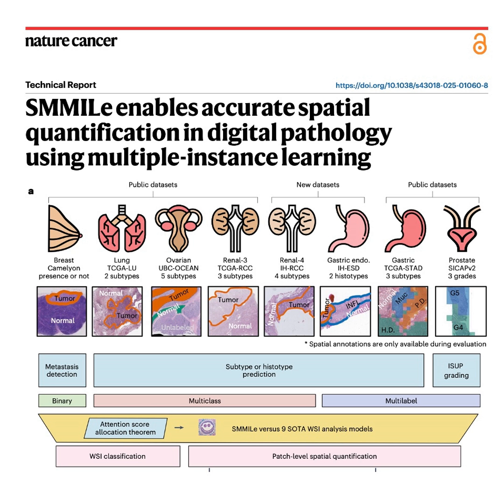But you don't just train an AI on cancer, you have to train it on healthy tissue too, which is where the consistency constraint comes in. Right. This is applied only to the negative bags, the slides with no tumor. Because if there's no cancer, the model shouldn't be fixating its attention anywhere. Exactly. The framework uses a mean-squared error loss function to force the model's attention to be completely uniform across the entire healthy slide. Oh, I see. It's teaching the AI the baseline. It learns exactly what boring, normal tissue looks like, which is the only way to drastically reduce false alarms or false positives later on.